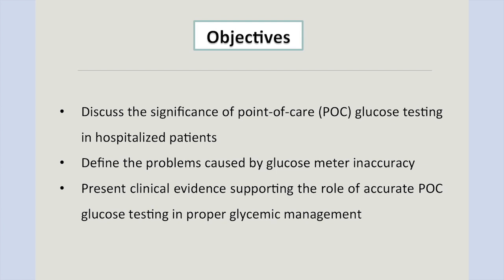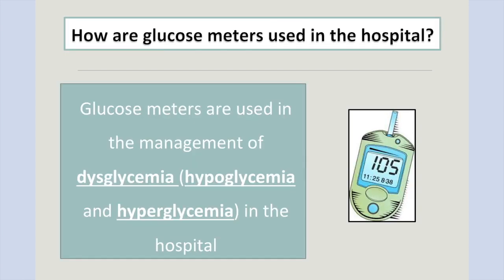So why do we use glucose meters in the hospitals? We use glucose meters because we are concerned about identifying the patients who are high or the patients who are low. NAM gave a very good outline of patients where you're looking at glycemic variability, going from high to low, and in critically ill patients with tight glycemic control, being concerned where you've got the patient going from high and then you cause them to go hypoglycemic, and you want to reduce your number of hypoglycemic events.